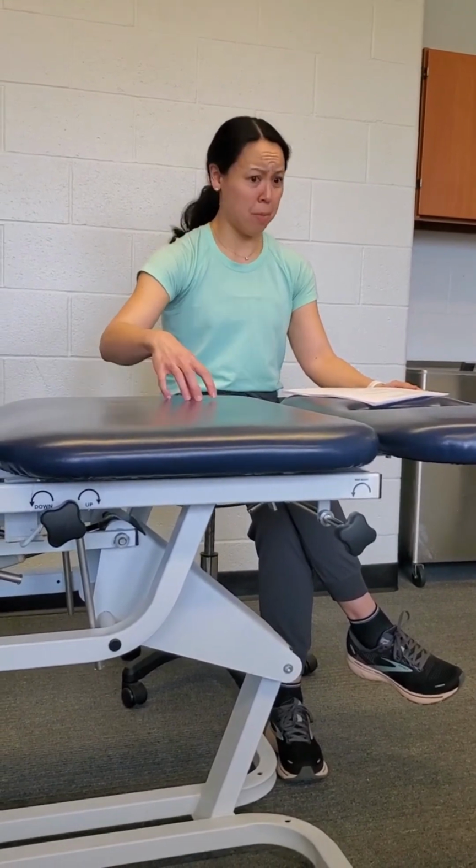Okay. In terms of charging, there's a couple of different things. There obviously isn't a code to charge for BFR yet, but you can pair it just like we would with another modality. I'm thinking of neuromuscular e-stim, where we could charge it under that, or you could charge it under Therex if they're doing an exercise while they're on the stim. So that's usually how you can charge it, as Therex. Therapeutic activity, if they're doing a squat or a lunge with the device on. If they're doing it passively, that's really the only time you can't charge it.